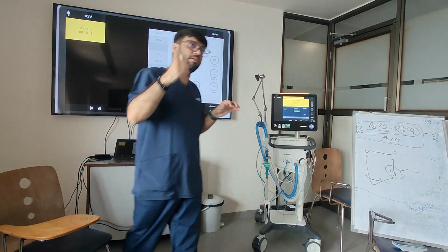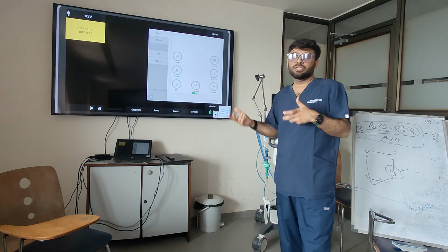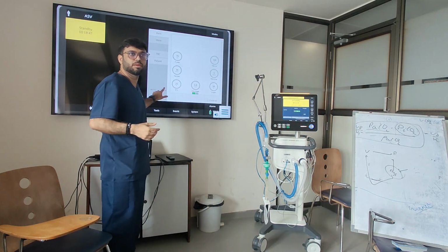But you think, this is only in case when I have normocapnia, normal metabolism, and normal lung function. But suppose there's any other patient who has increased metabolism, fever, CO2 retention, all that, you can change your minute volume. So I would put it this way.